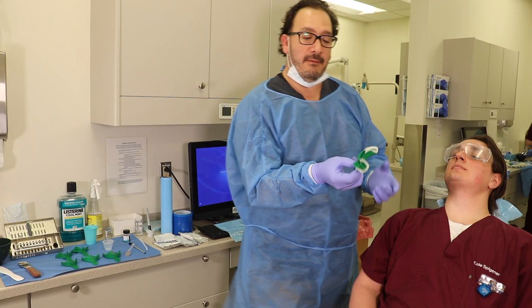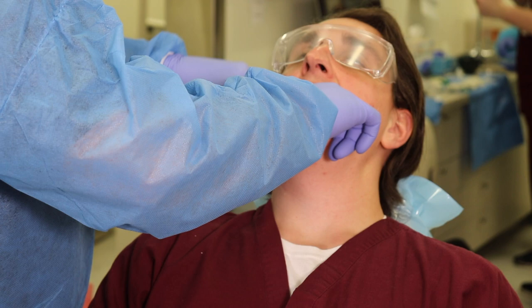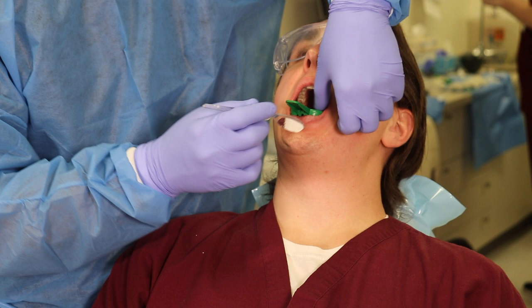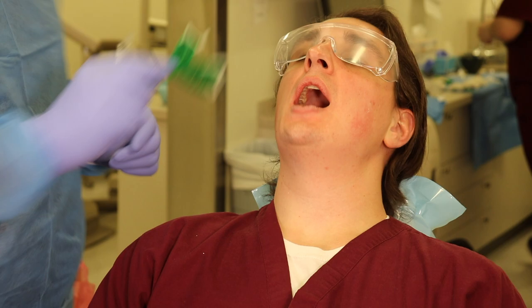Now, I take it back to the patient's mouth. Again, I retract on one side. I set it right there. And I need to make sure that the tray covers entirely all the teeth, okay? This is what I'm looking for. So this tray is a good one for that. I want to try the upper one now.